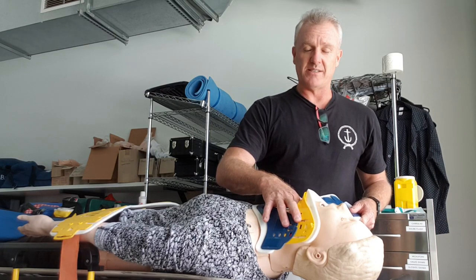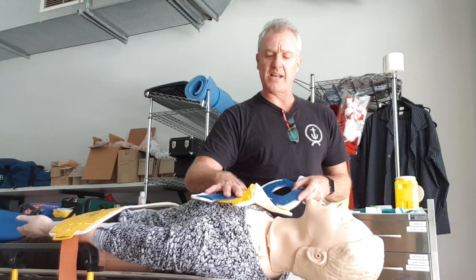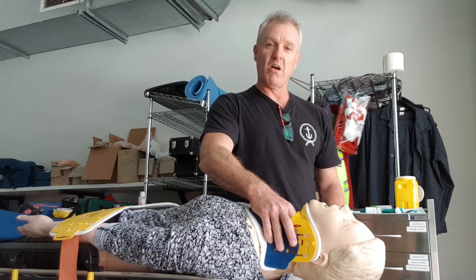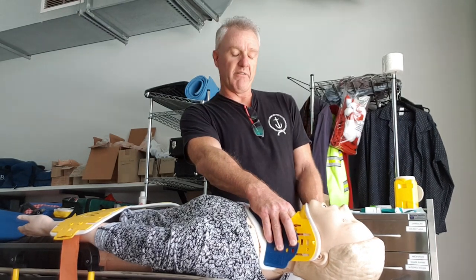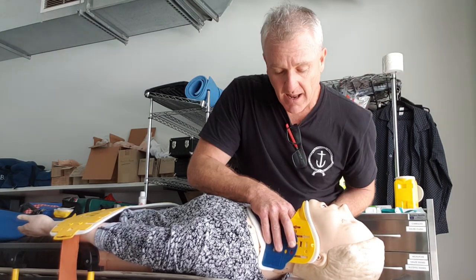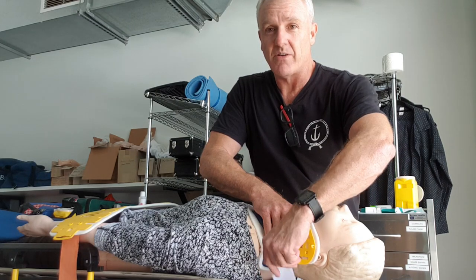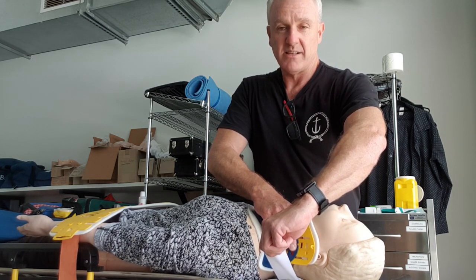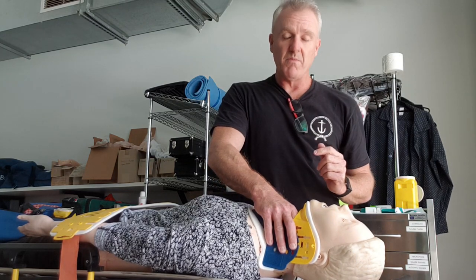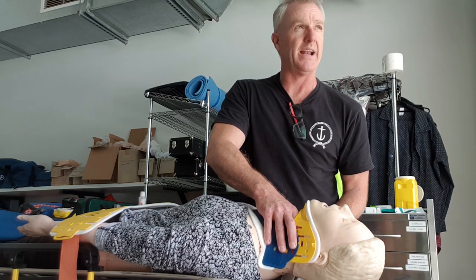I don't come straight at the patient's face or neck or chin. I start out on the patient's chest, making the collar as flat as possible, and I slide up and underneath the chin. I'll mould the opposite or the short side around the patient's neck, and then I take this side and feed it through underneath the patient's neck. I look for the Velcro or the frame to come out the other side, then I take the Velcro and pull it out. My right hand is still controlling the patient's head — my index finger is actually on the angle of the patient's jaw — so I'm holding the collar but also controlling and immobilizing the patient's head.